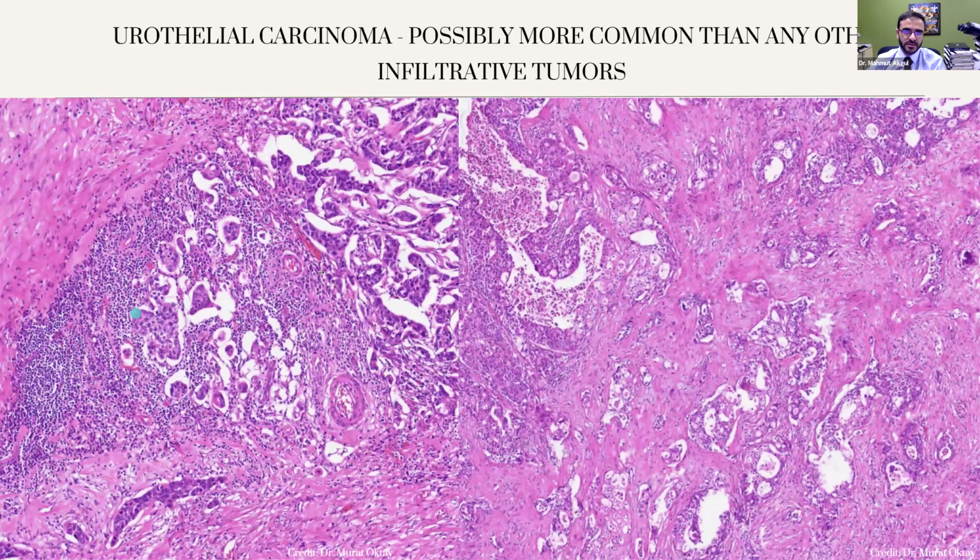Let's start talking about molecularly defined renal carcinomas. It is somewhat vague and confusing terminology. We have quite a few tumors where you need to show their molecular alteration to diagnose them. The entity that I'm going to tell you about first is an emerging entity, but they are most likely infiltrative in nature. So this is another recent case of a 56-year-old female with a 4.8 centimeter renal mass.